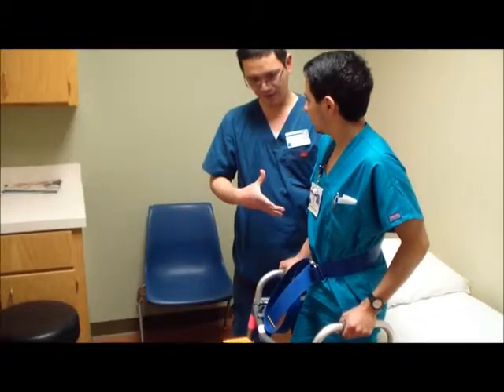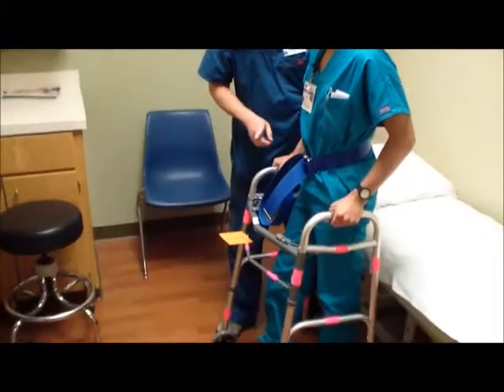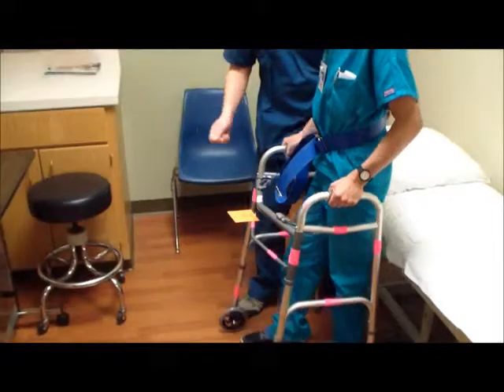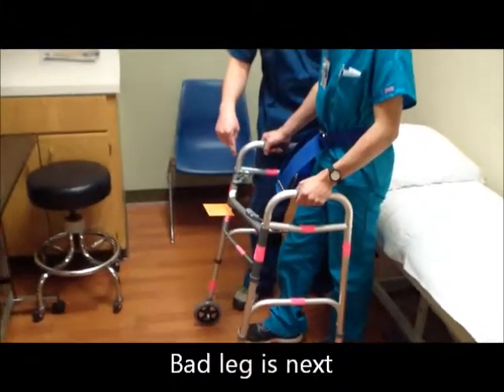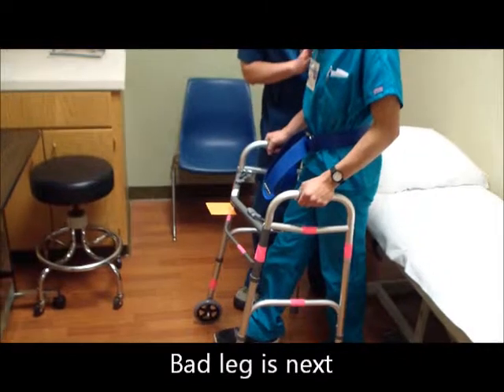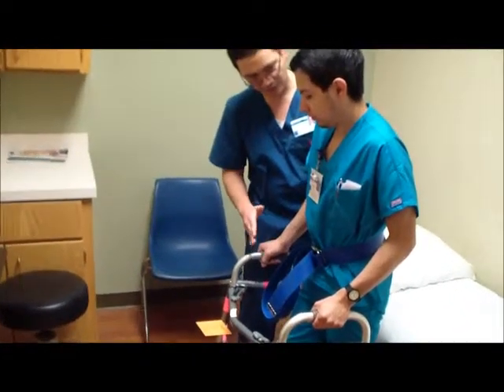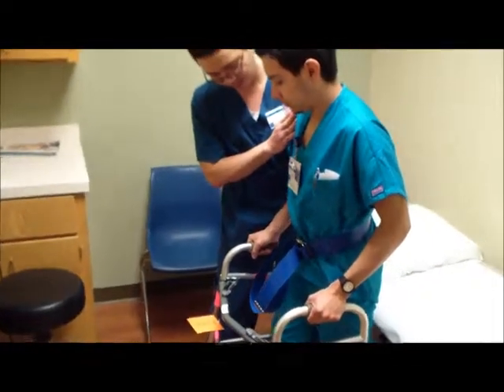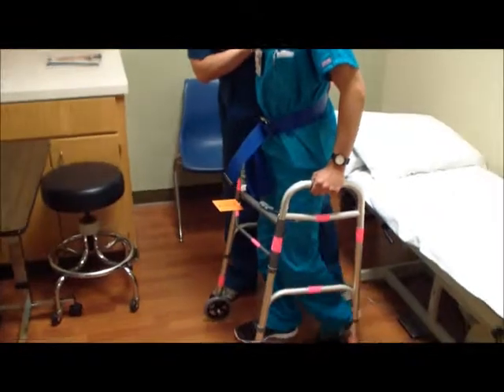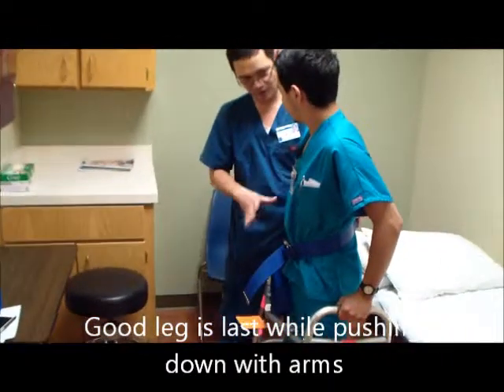Okay, and so now we'll be walking, and I'm going to give instruction to Matthew on how to walk with the walker in the proper sequence. So the first is you want to push the walker forward just a little bit, and then bring your right foot forward. And then as you shift your weight towards that right leg, you want to push down on the walker. Okay, so go ahead and step forward and push down on the walker. When you do that, you're helping your leg with your arms.